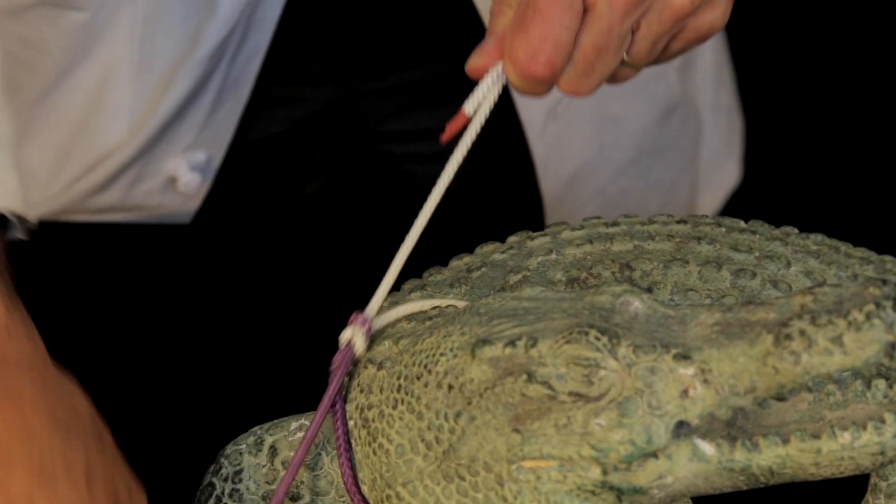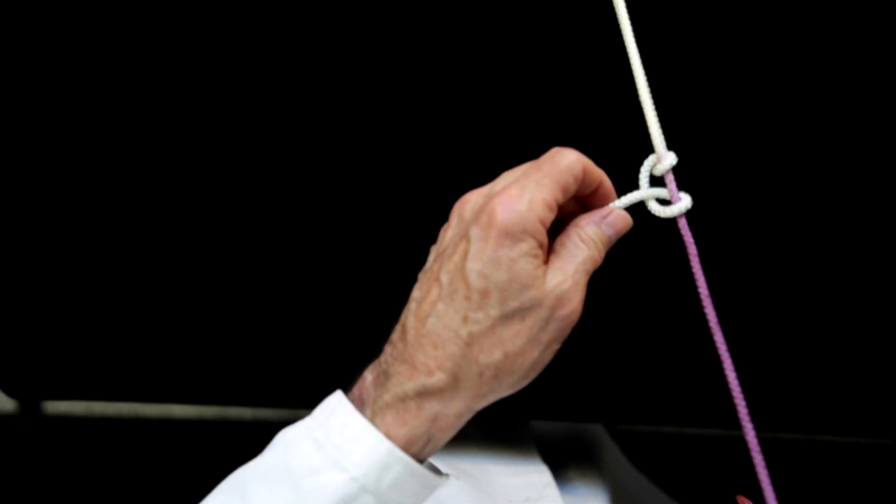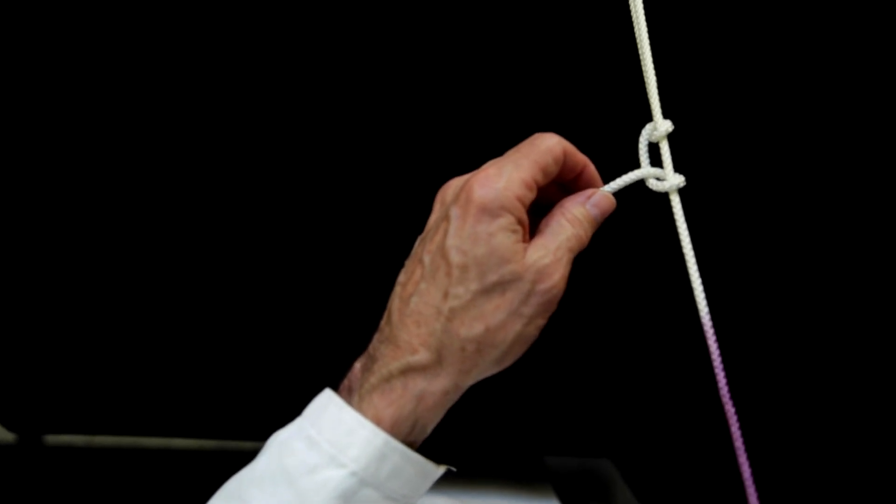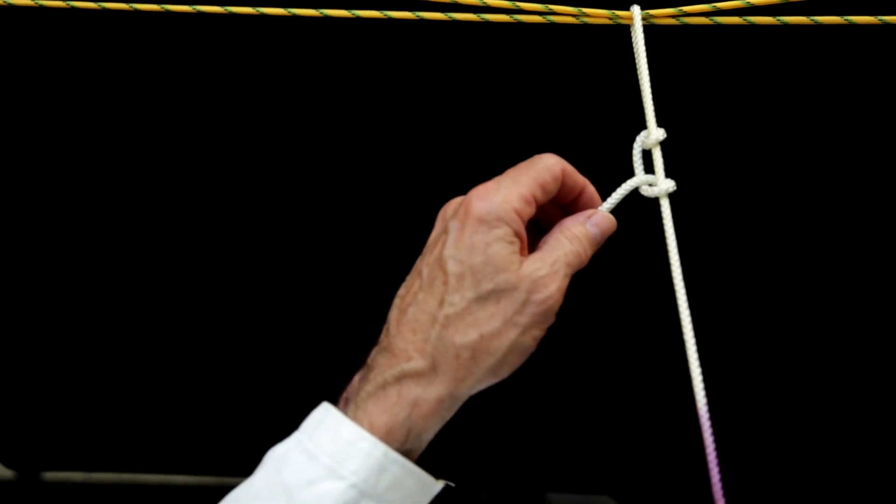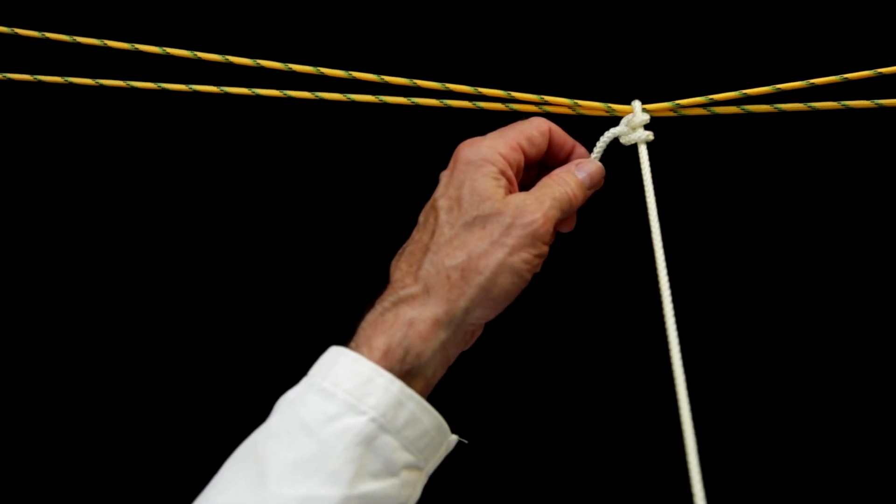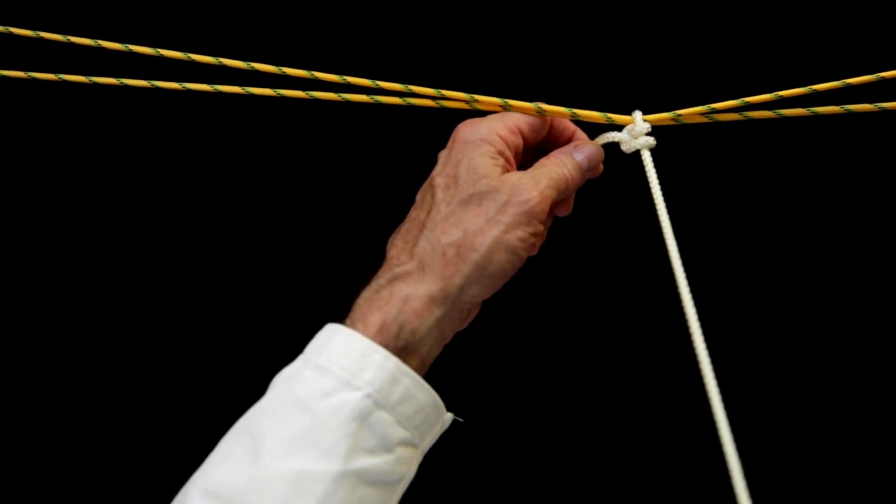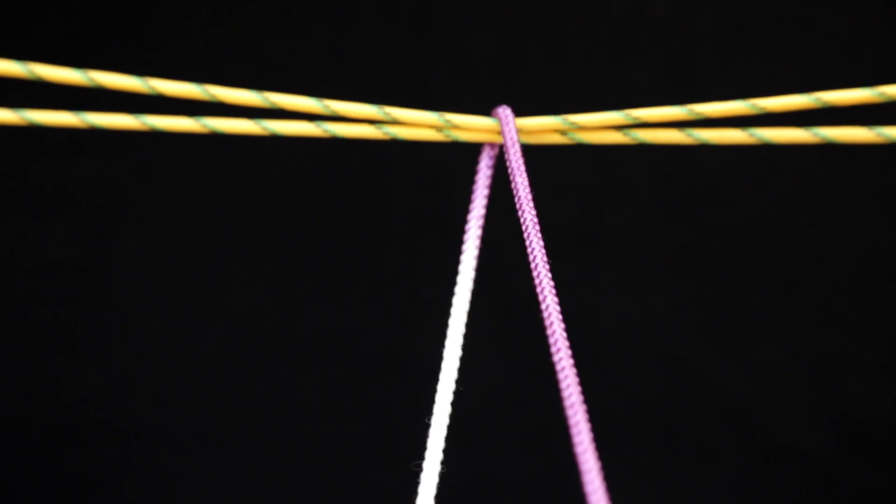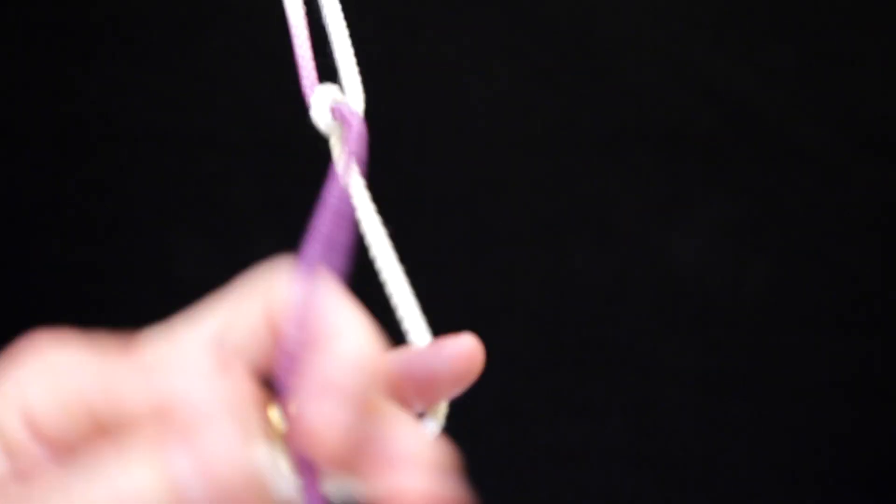To accomplish that, I suggest you forget most of the things people have tried to teach you about tying square knots. Your goal is to create loops that slide like rings down a stick. To do this, put all of the tension on one arm of the suture with one hand. Then throw loose loops around it with the other hand.